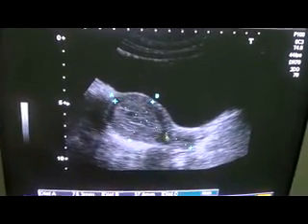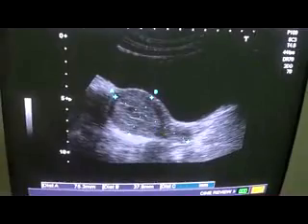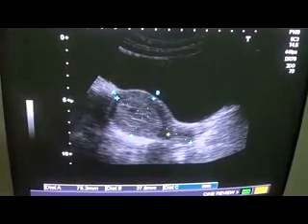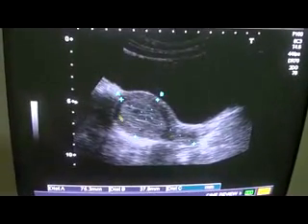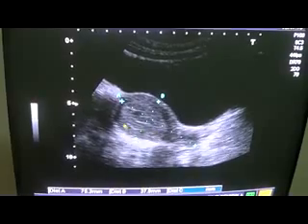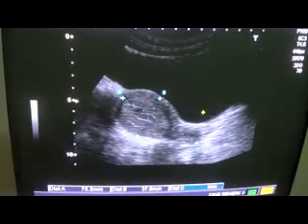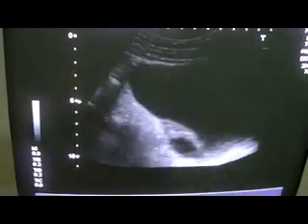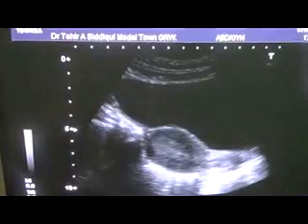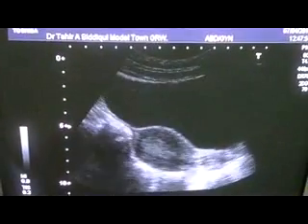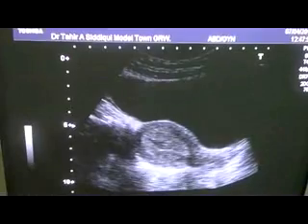This is the anterior myometrium, this is the cervix, this is the posterior myometrium. Now there is an area of interest to be noted which is the possible cause of menorrhagia.